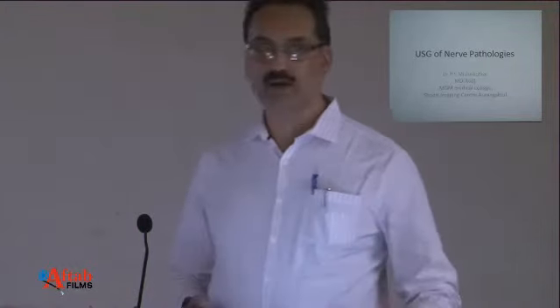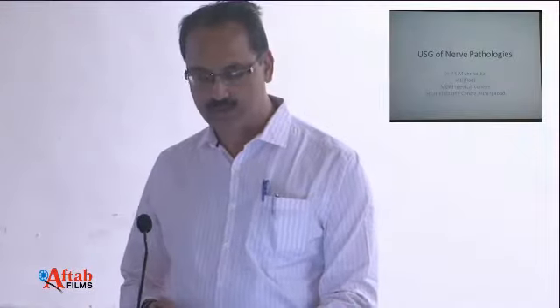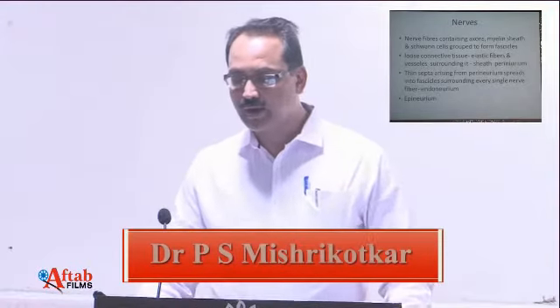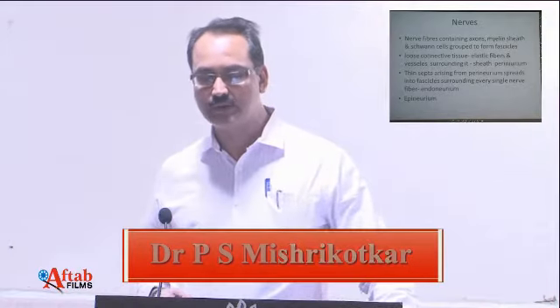Now, I'll be covering ultrasound of the peripheral nerves, which is the best modality available right now for the evaluation of the peripheral nerves. So, the basic ultrasound technology, how it is to be done, and then we'll have a discussion of cases.